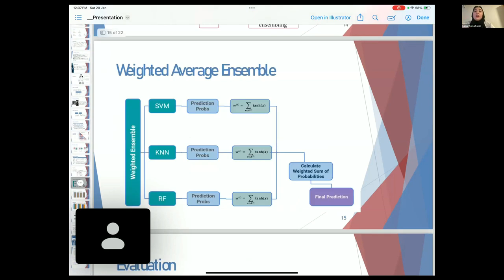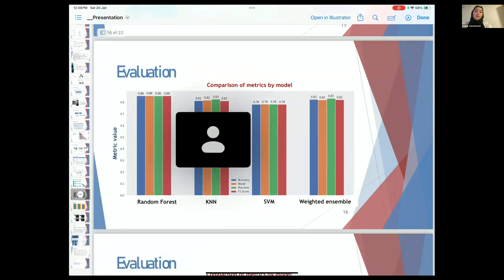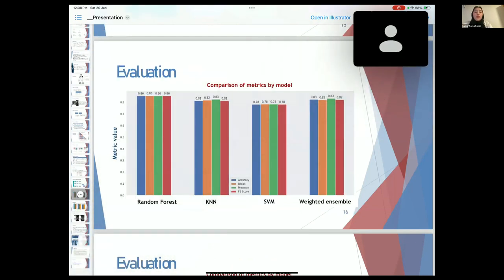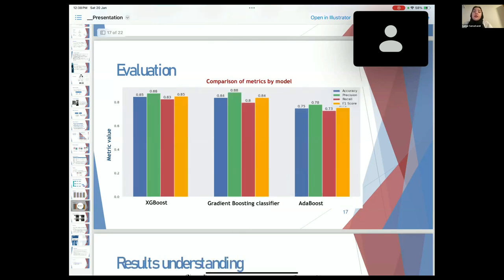This is how it calculates and processes it to get the final prediction. As you can see, this is the comparison of metric models that all average around the same, with the highest performance coming from the random forest model and the XGBoost.